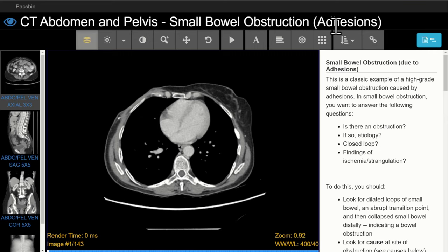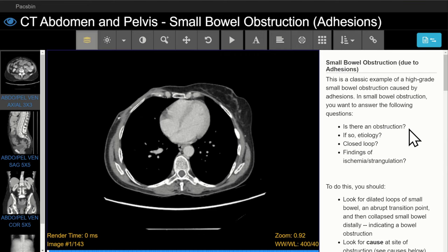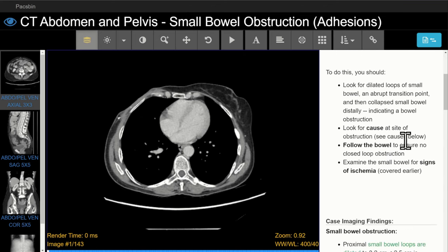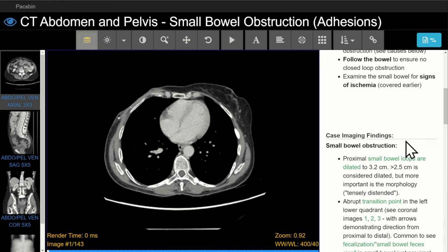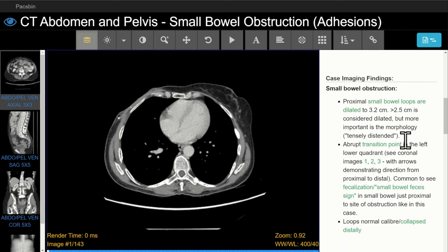For this first case of small bowel obstruction, I take you through my approach to looking at small bowel obstructions on CT so that you know what to look for. As part of this approach, we want to answer the following questions: one, is there a bowel obstruction? Two, if yes, what is the cause of the obstruction? Three, is there a closed loop obstruction? And four, are there complications — specifically, are there signs of bowel ischemia? In the answers, we go through how to practically answer those questions and walk through the imaging findings following that approach.